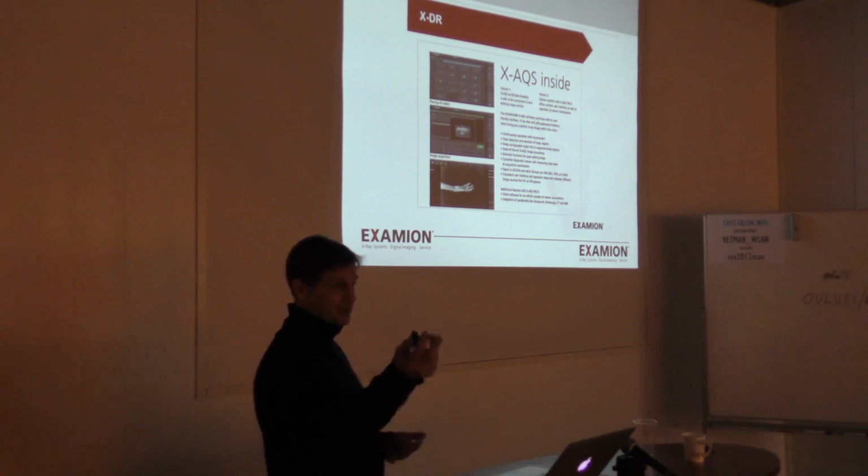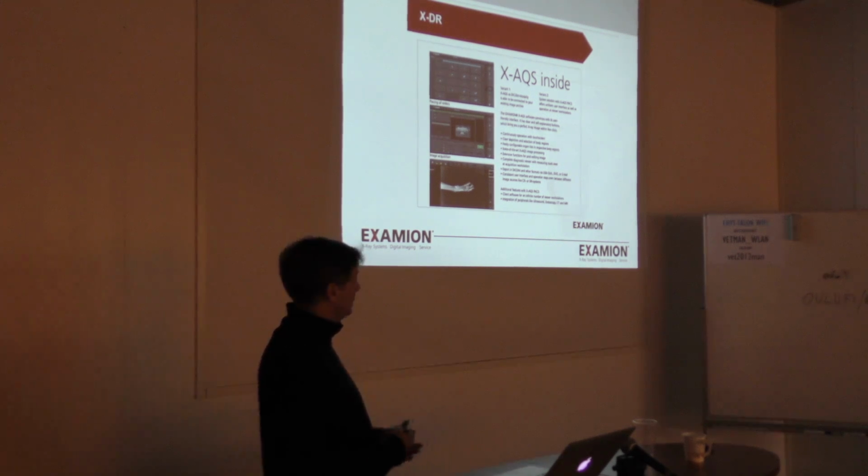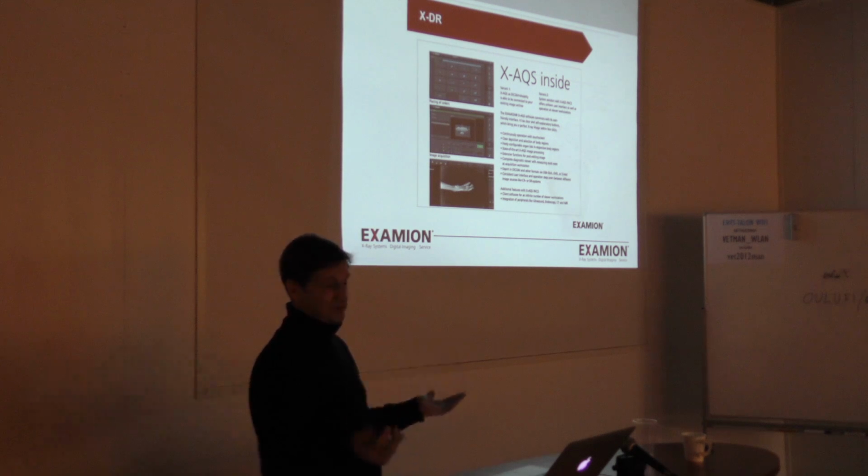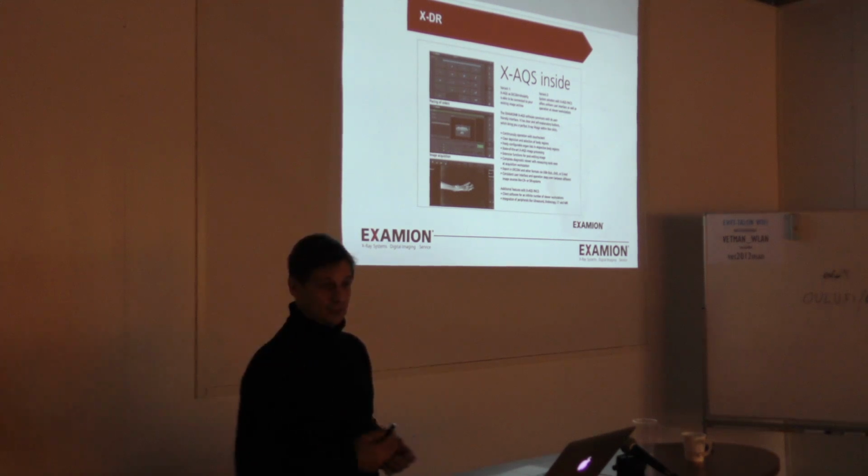And then also sending the images outside. You archive them. Most of these systems have a RAID 1 PACS archive, which means that all the data are automatically backed up at any time within one station, and that can also be upgraded to a RAID 4, for example, where the data are synchronized between computers which are not in the same room or not even in the same clinic, or in the cloud or whatever.